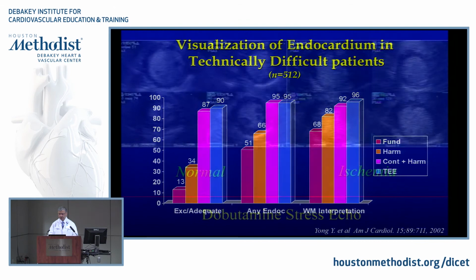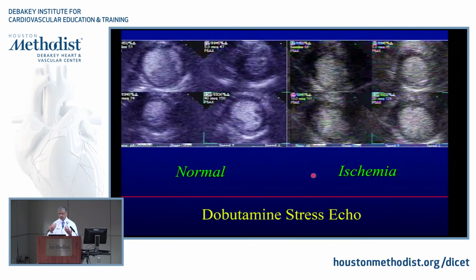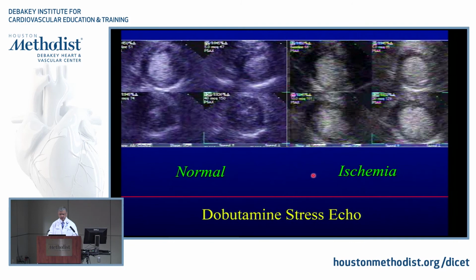How about stress? If you're gonna use contrast with stress, better use it at all stages, from rest all the way to exercise, so it's easier for you to interpret, right? Once you load the heart with contrast, you need some topping off. You don't need to use as much, so you don't overall attenuate, so you'll make sure that you do that, and you'll go through your regular routine stress echocardiography, et cetera.